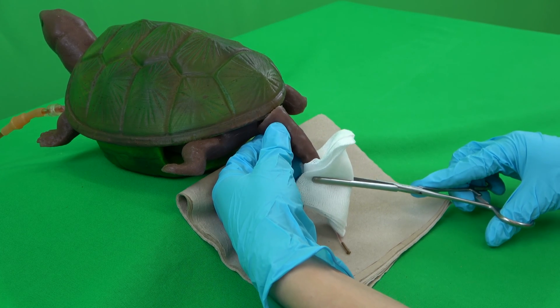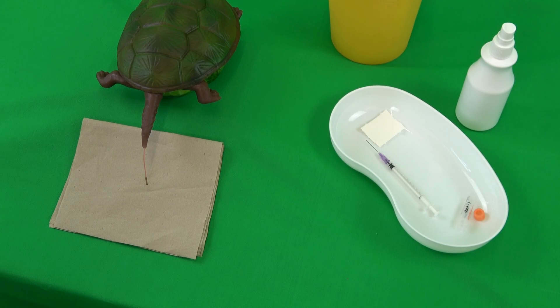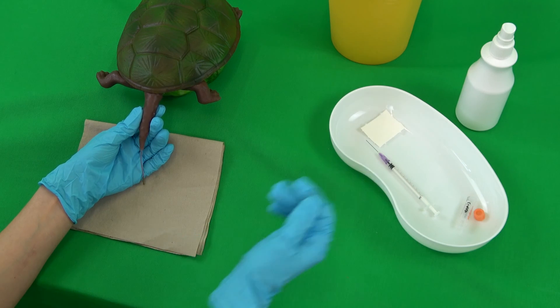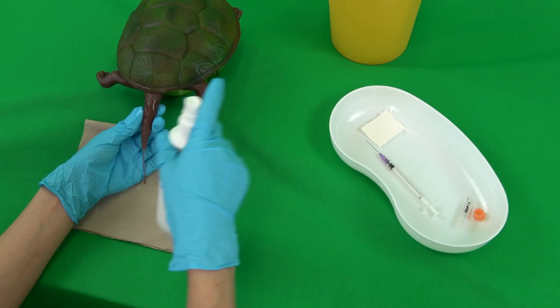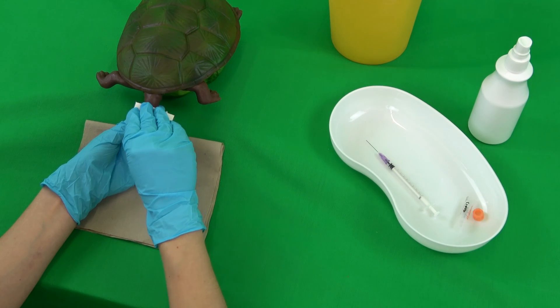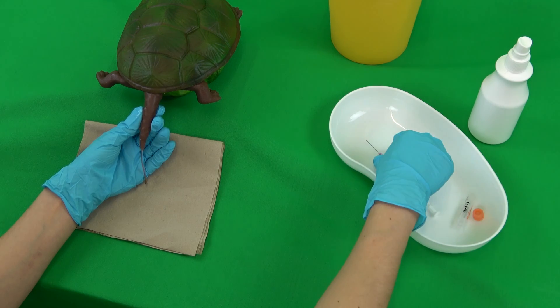This should be cushioned slightly with gauze pads or compresses. The puncture site is sufficiently disinfected. Grains of sand stuck between the scales may become loosened. The area is then dried with swabs — wipe the swab once in one direction over the puncture site. If necessary, the same procedure can be used with additional swabs.